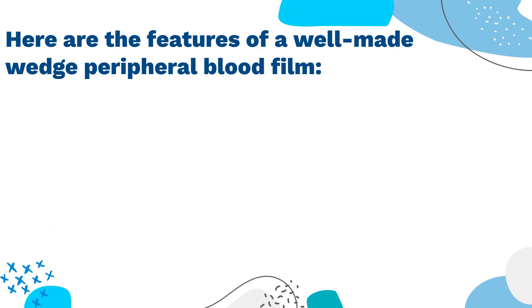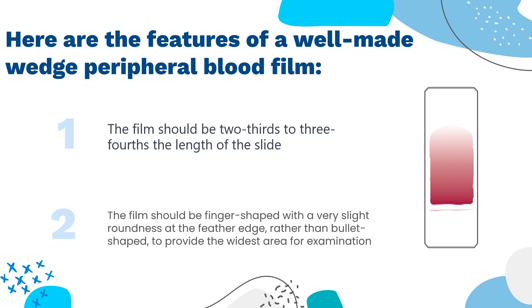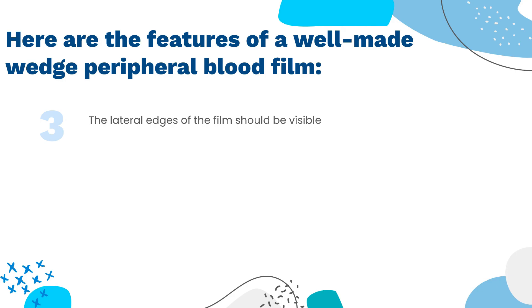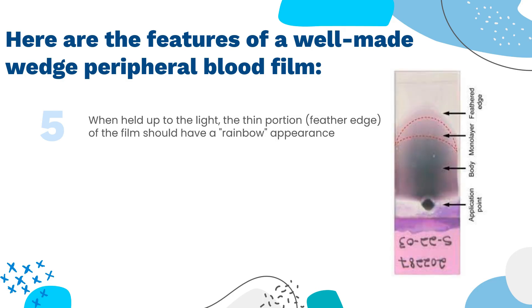Here are the features of a well-made wedge peripheral blood film: 1. The film should be two-thirds to three-fourths the length of the slide. 2. The film should be finger-shaped with a very slight roundness at the feather edge, rather than bullet-shaped, to provide the widest area for examination. 3. The lateral edges of the film should be visible. 4. The film should be smooth, without any irregularities, holes, or streaks. 5. When held up to the light, the thin portion, or feather edge, of the film should have a rainbow appearance.